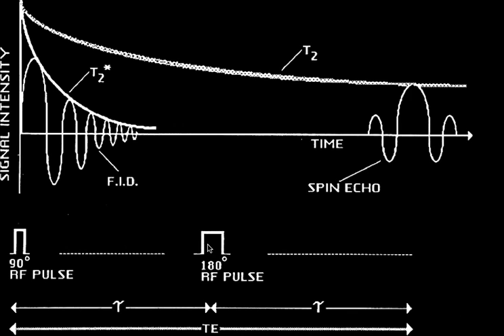So what happens then, the 180-degree pulse flips all the spins around. The fast guys become very far behind because they're as far behind as they were ahead before. And then if it keeps going fast, it will catch up to the slow guys, and at time 2 tau, they'll all come together and produce a spin echo. The bulk magnetization vector will no longer be zero in the XY plane. We'll have a rotating magnetization that will induce current in our receiver coil, and we'll get an echo in the wire coming into the computer. Okay? Just backing up to some basic understanding.